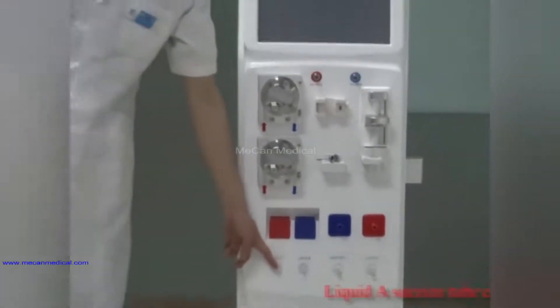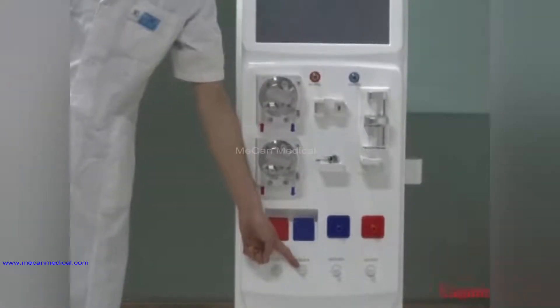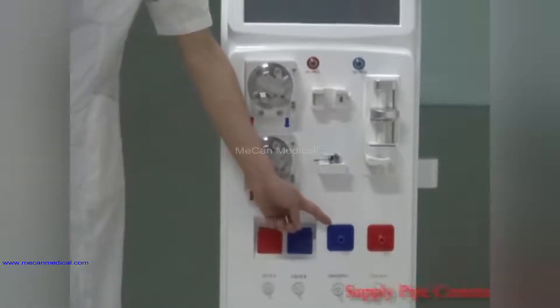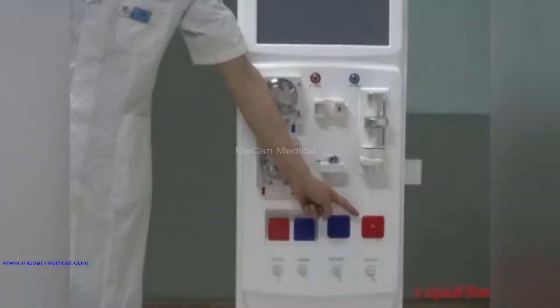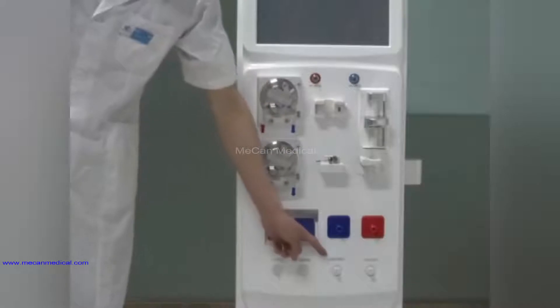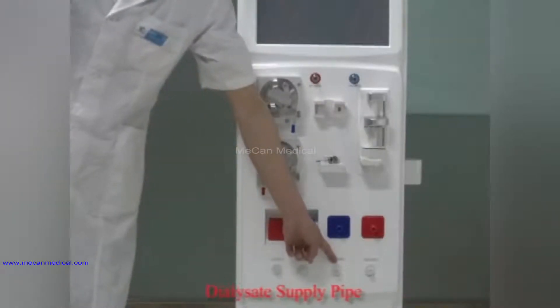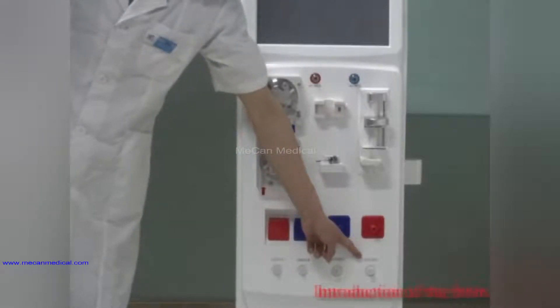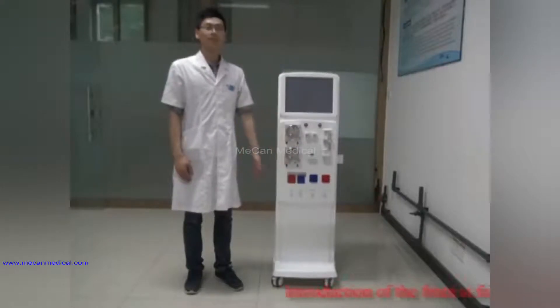Here are the liquid A suction tube connector, liquid B suction tube connector, supply pipe connector, liquid return pipe connector, dialycet supply pipe, and returned dialycet pipe. Introduction of the front is finished.